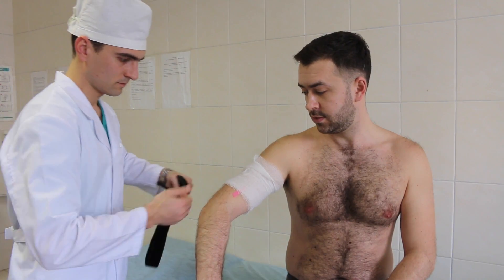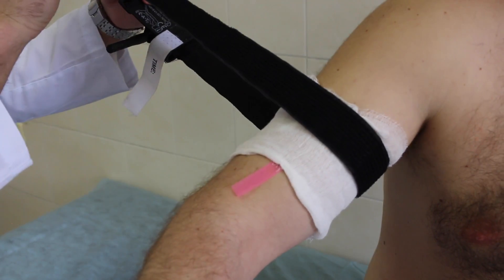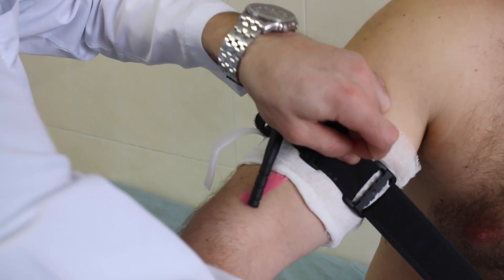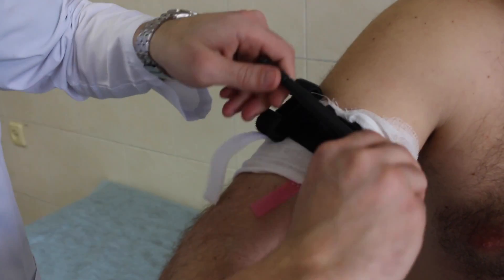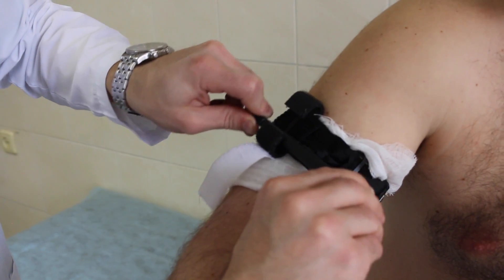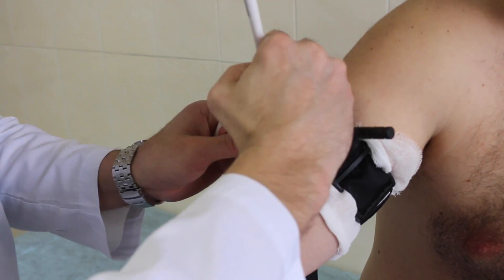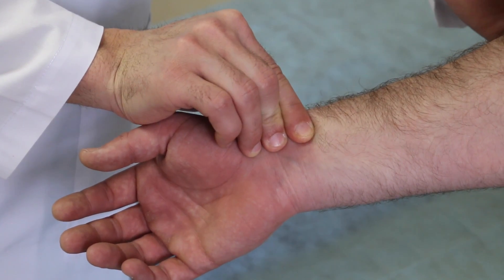Next, you should tightly wrap your tourniquet and fixate it with adhesive tape, and use a plastic stick as a tertiary device. Twist the plastic stick until the tourniquet is tied around the injured limb and the bleeding stops. Write the tourniquet application time on the tourniquet directly and mark the victim's forehead with a T. Criteria of tourniquet efficiency are stop of the bleeding in the wound and absent pulsation on distal arteries.